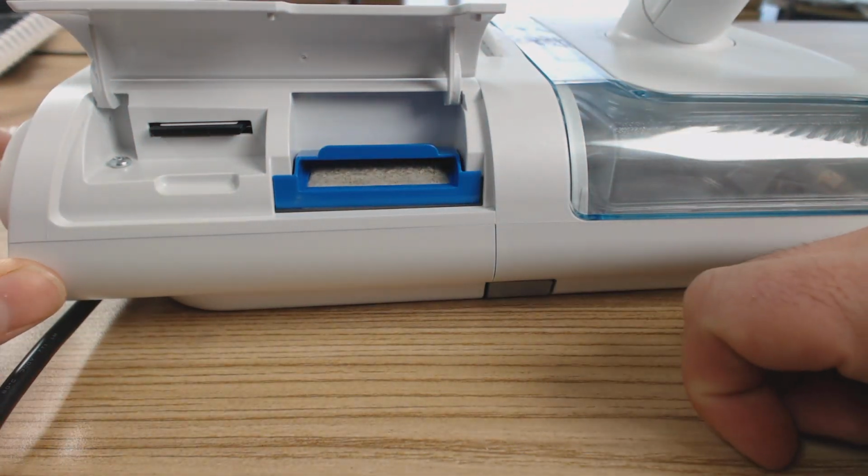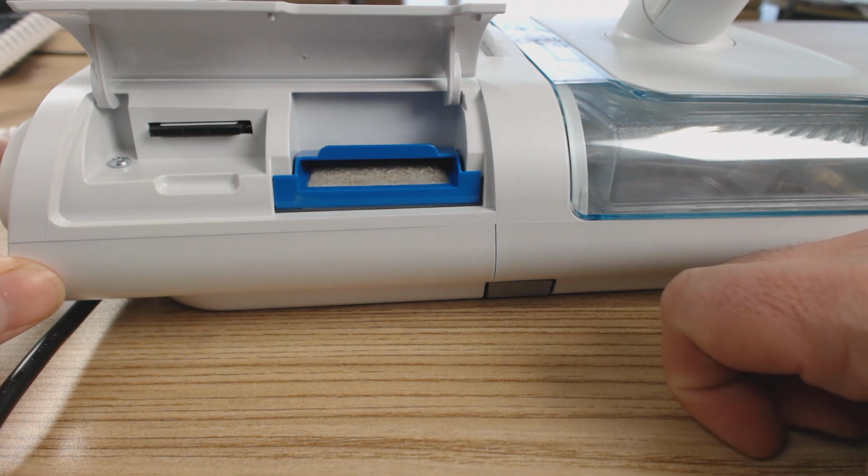I know it sounds often, but if you're changing your filter every 30 days, your machine's going to last that much longer. The air you breathe is going to be that much cleaner.